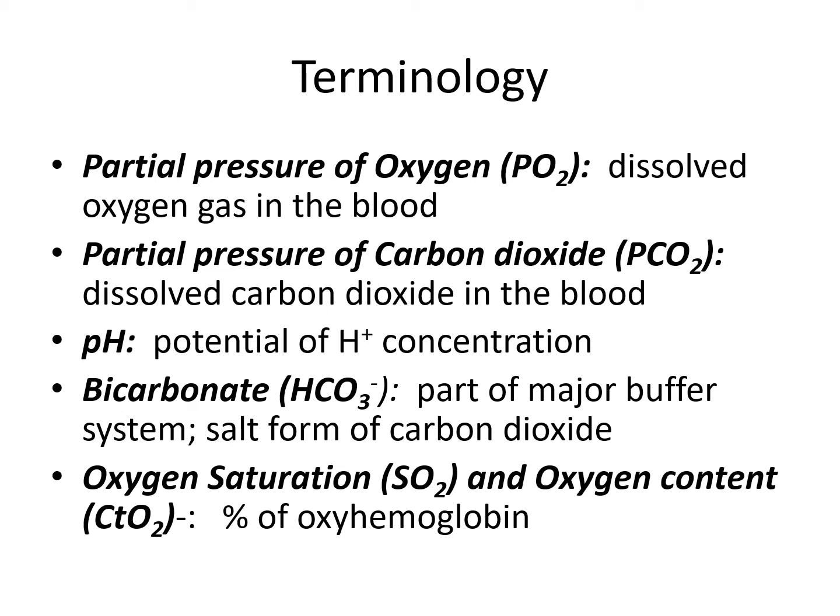And bicarbonate, so this is an ion that is usually part of a buffer system in the blood. And then oxygen saturation, SO2, and oxygen content, total oxygen content, CtO2. This is reflective of the percentage of oxygenated hemoglobin.